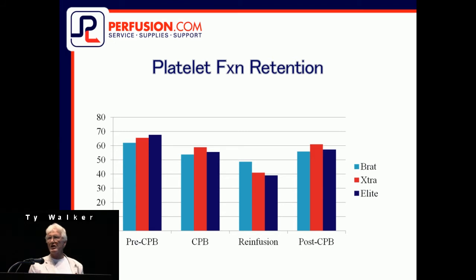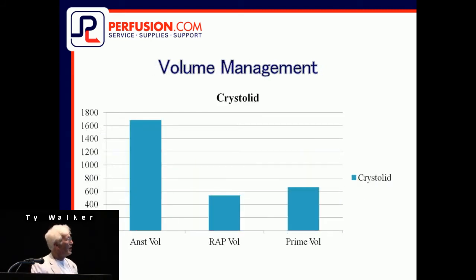Now, you can go through a hemoconcentrator. We don't hardly ever use a hemoconcentrator at some of our institutions. But by doing this, it's much cheaper, much better. I think we can get just as good or better results, and we can reinfuse the whole pump blood and not miss a thing, and flush the circuit out and have a prime circuit ready to go back on during these procedures. So what did I tell you that we found out about the worst enemy during the case?